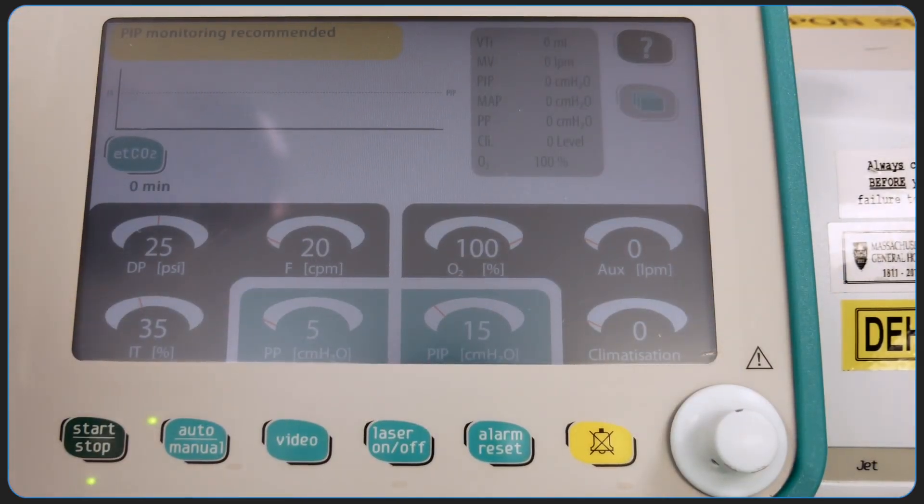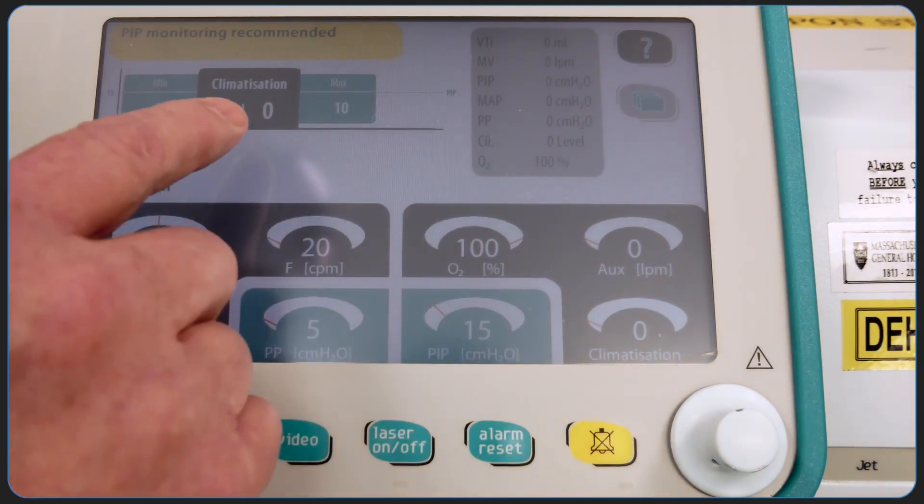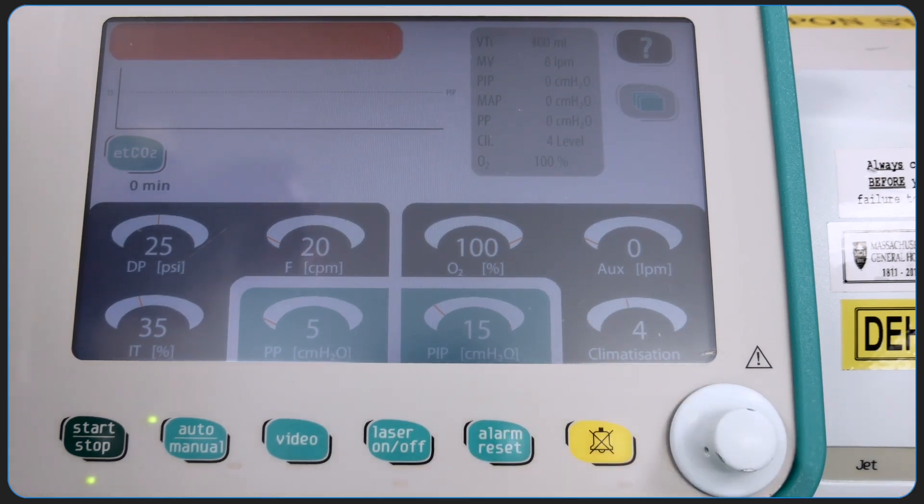The machine has a touch screen to modify parameters and settings. To operate the touch screen, press and hold the buttons on the screen. The hold feature is a safety feature to avoid inadvertent changes.